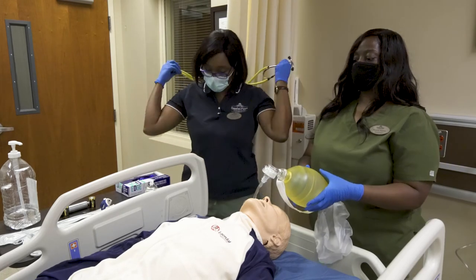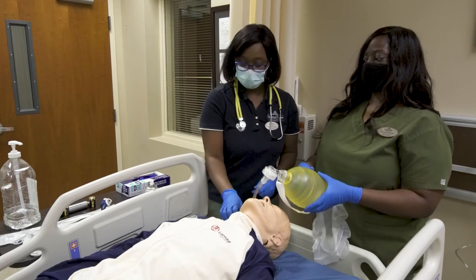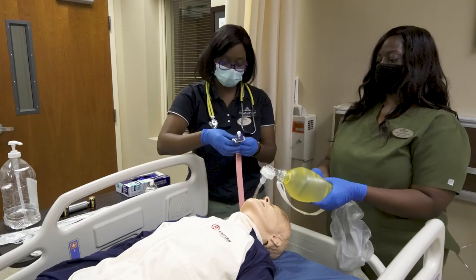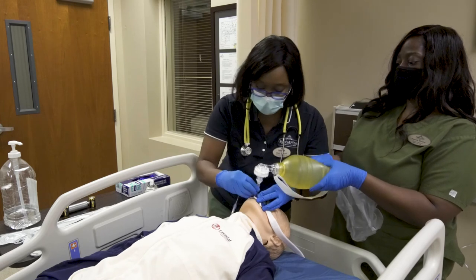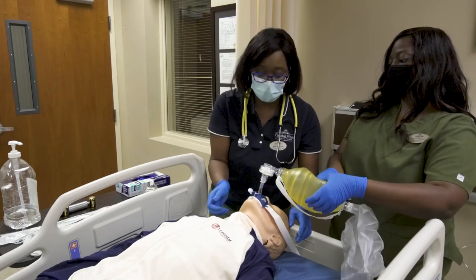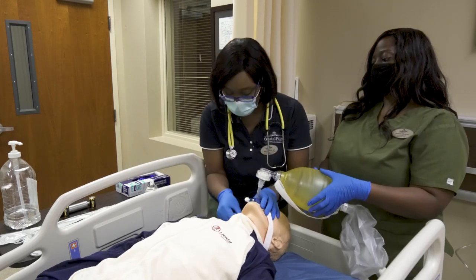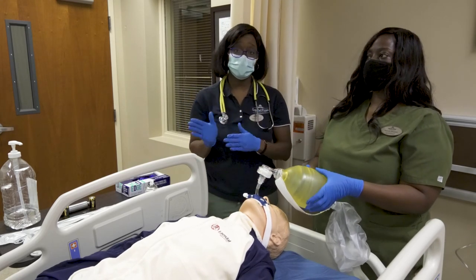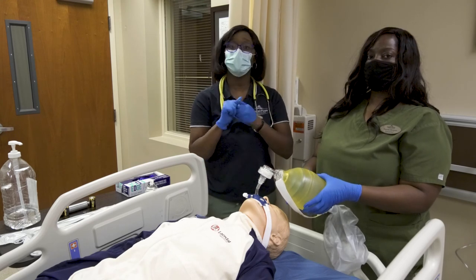Now we have bilateral chest rise. Once we have achieved bilateral chest rise, we will attach the tube holder, making sure that the tube is firmly secured. Once the tube holder is in place and the tube is firmly secured, you will attach your oxygen source, whether it is a ventilator or ambu bag. Next, you will dispose of your PPE.